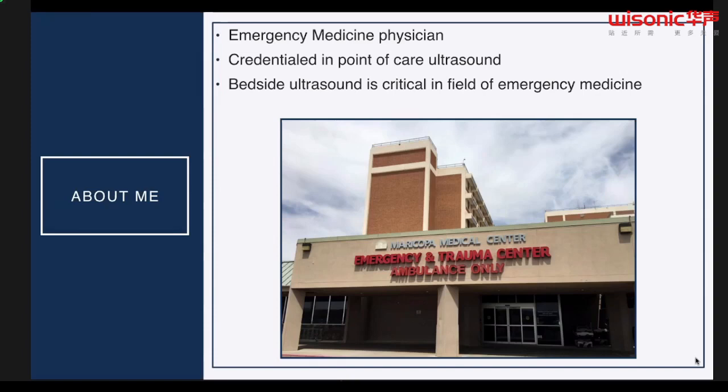I just worked a shift earlier and I did 2 just for the eye, and it's fantastic to look at all sorts of pathology all throughout the body. So that being said, today I'll be talking about musculoskeletal ultrasound, and specifically for the knee. We use it all the time for musculoskeletal ultrasound in the emergency department and outside of it.